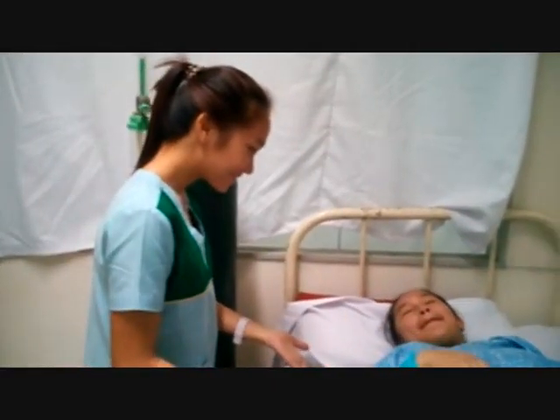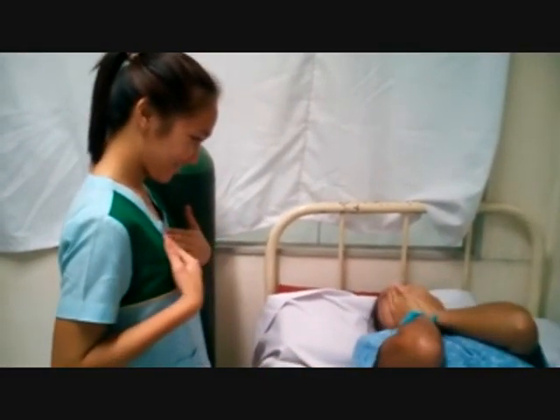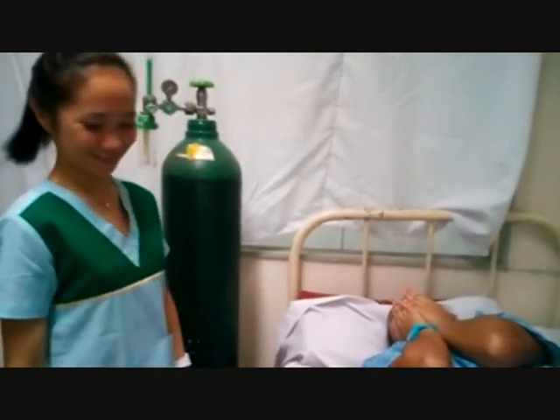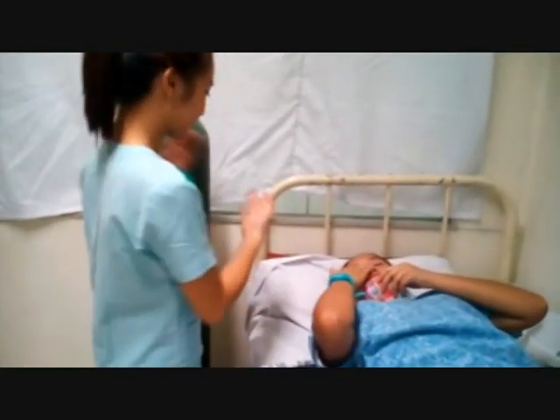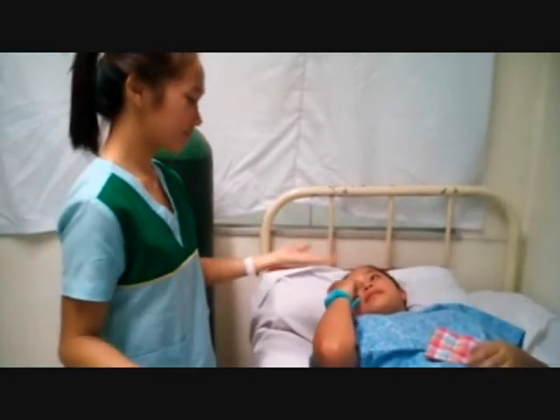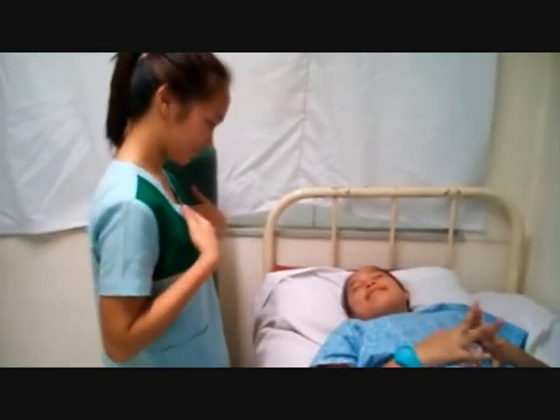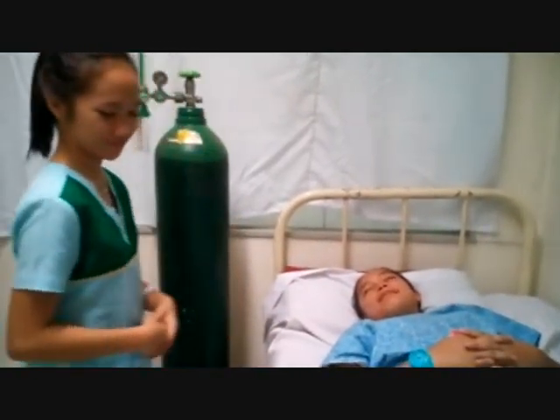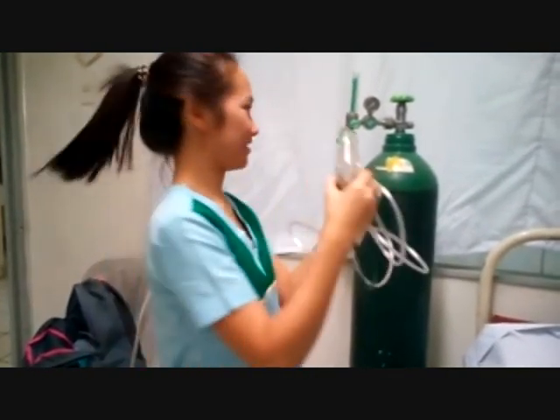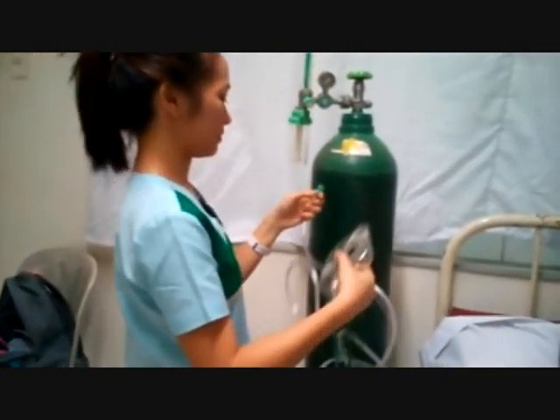Identify the patient. Explain what you are going to do and the reason for doing it to the patient. Review safety precautions necessary when oxygen is in use.